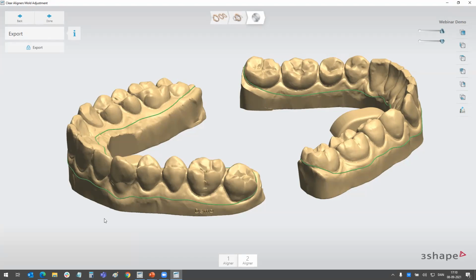But if the clinic is okay with registering their in-house lab as a real full-blown orthodontic lab to the FDA, and they also register their aligner brand with the FDA, then theoretically they will just become a normal Auto lab, and then they could buy the Auto item number and get the cut line functionality. But unfortunately, a clinic in-house lab cannot do it in the US unless they do that. In the rest of the world, it's a free-for-all. If the software is approved, then you can use the cut line functionality in those markets.